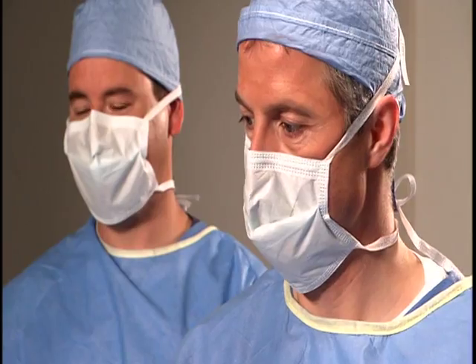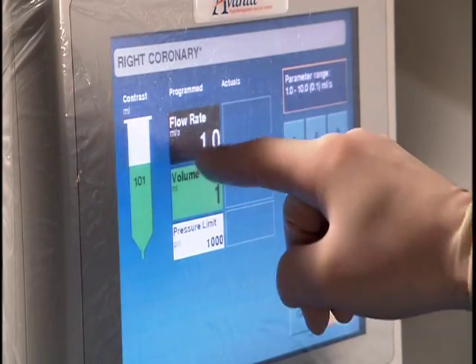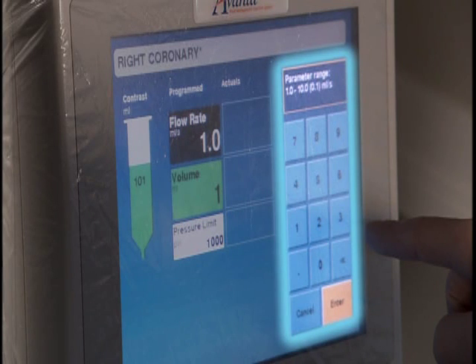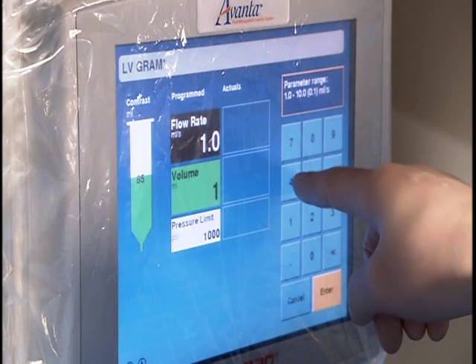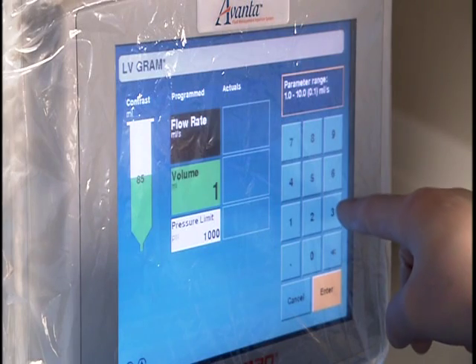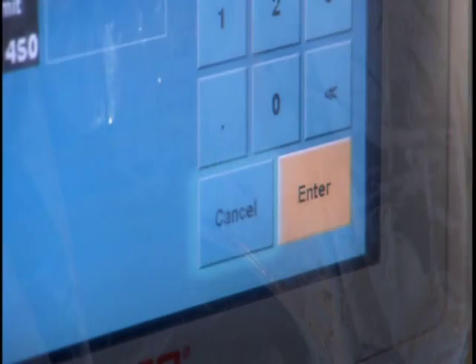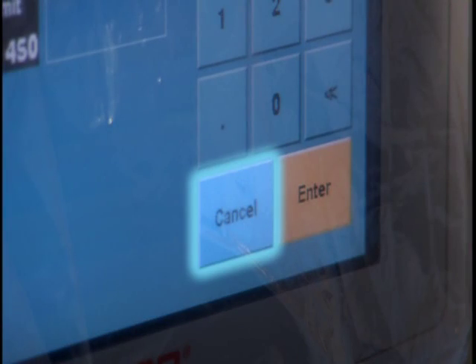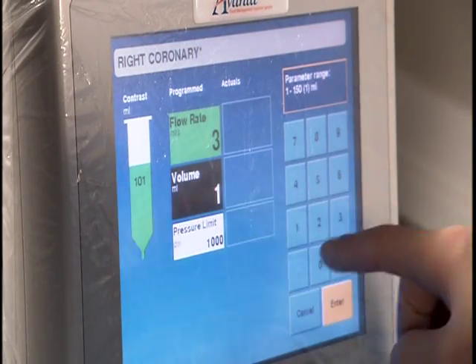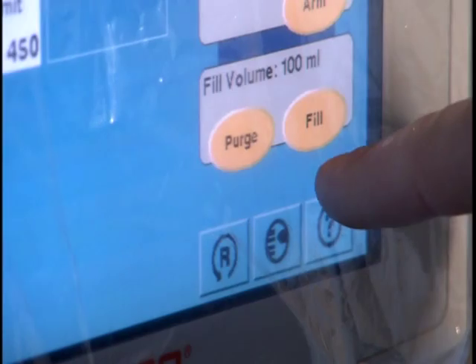Set your parameters by touching any programmable block that appears under the Programmed column. When you touch any of these blocks, a numeric keypad and available range window will appear. You may enter the value, edit the value by touching the left arrows, or cancel to restore the original value. You can lock in a value by simply selecting another parameter or by touching Enter.